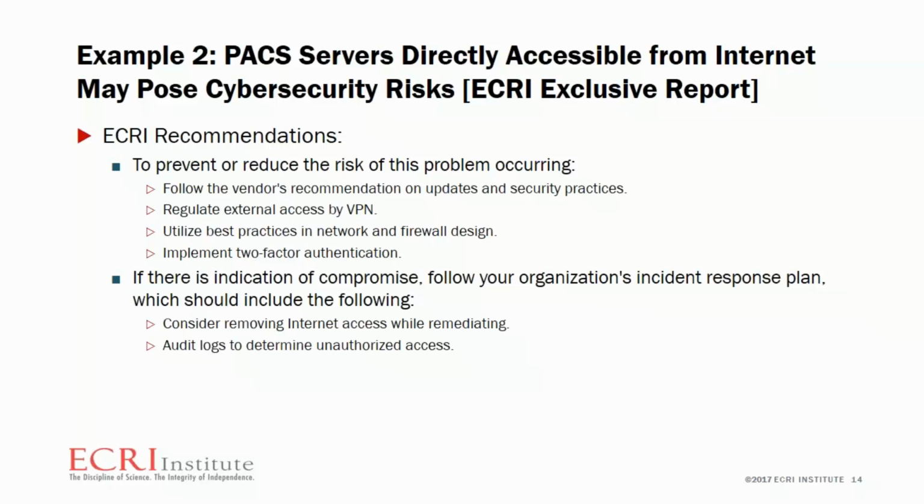A couple other things to keep in mind is, especially if external access is required, utilize VPNs, as well as use best practices for network and firewall design, and implement two-factor authentication as well. Always, if there is an incident or suspected incident, absolutely initiate your incident response plan, and also make sure to include the instances of if it is specific to a medical device. And part of that is also going to be considering whether you should disconnect the device for the duration of the remediation. That is always an option.